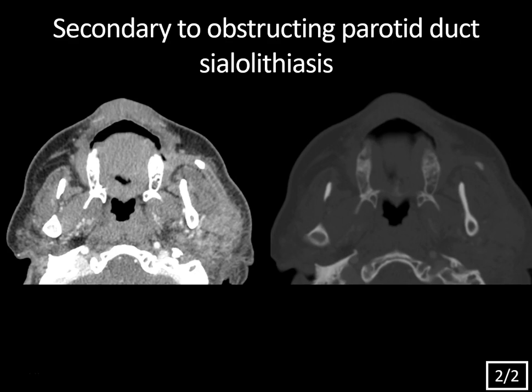Now let's discuss the course of the parotid duct. The duct arises from the anterior aspect of the gland in the parotid space, but then it passes along the surface of the masseter muscle. Here's the left masseter muscle, and there's the right masseter muscle for comparison. At that point, it passes through the buccal space, which is this fat-containing space, and then pierces the buccinator muscle right here. And here's the contralateral buccinator muscle to compare. It opens up at the level of the upper second molar. A landmark for the duct is the facial vein, right here. Often the zygomaticus muscle will be anterior to the parotid duct, so the duct will be the second curved line, and the facial vein will be between these two curved structures, all within the buccal space.